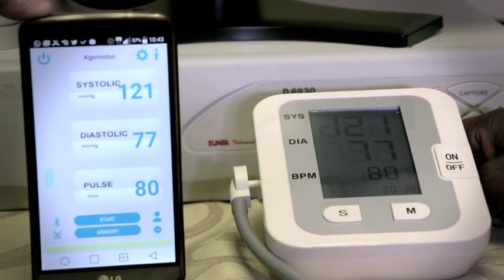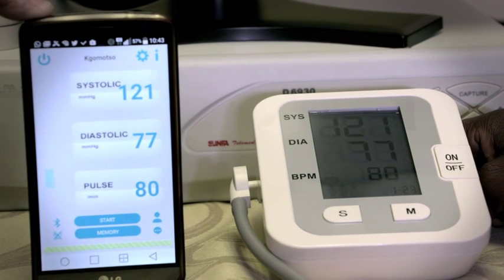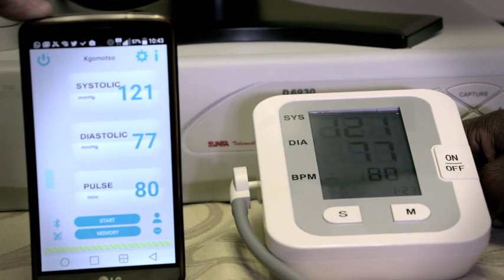Your pulse is 80 pulses per minute. According to the World Health Organization standard, your blood pressure level is normal.